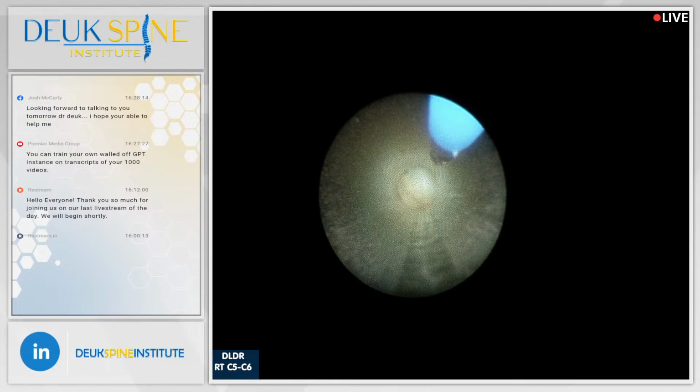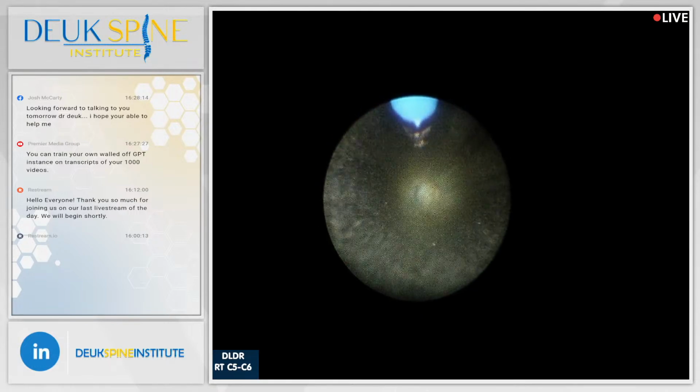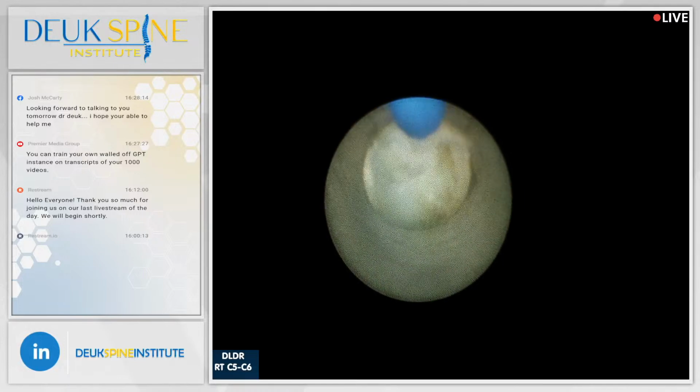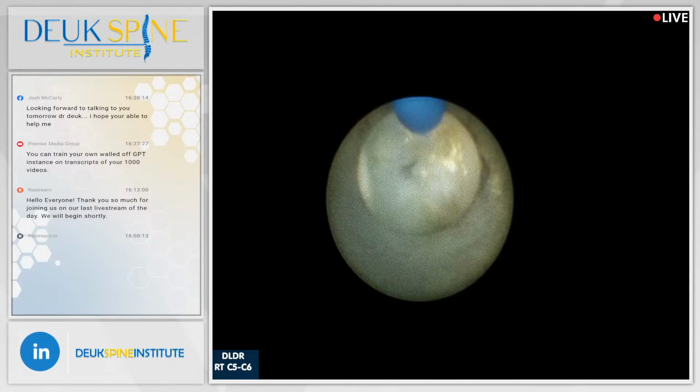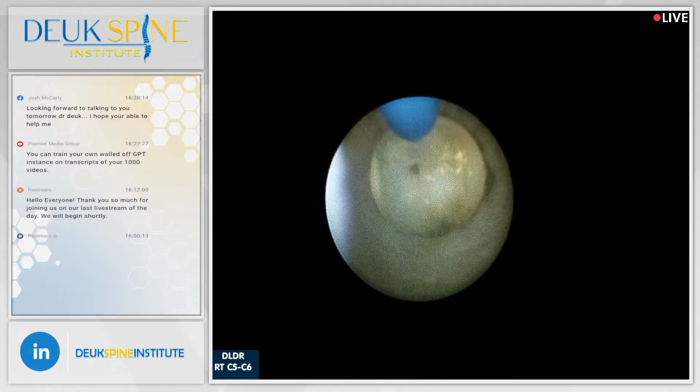I'm going to flip my scope and start looking the other way. We've pretty much cleaned out the foramen on this side, but let's go see where else there's problems. We haven't really gone to the other side yet. Oh, there's a tear right there. You guys see the tear in the back?